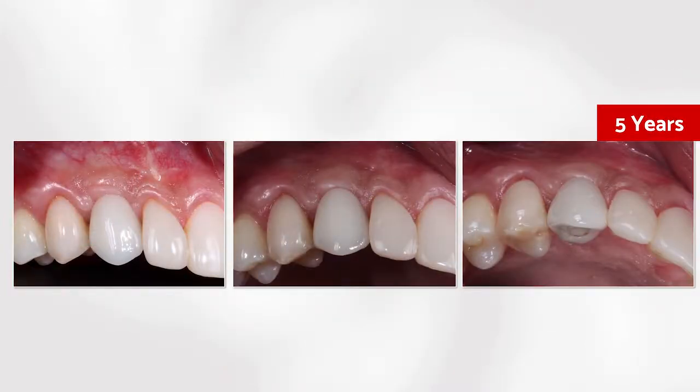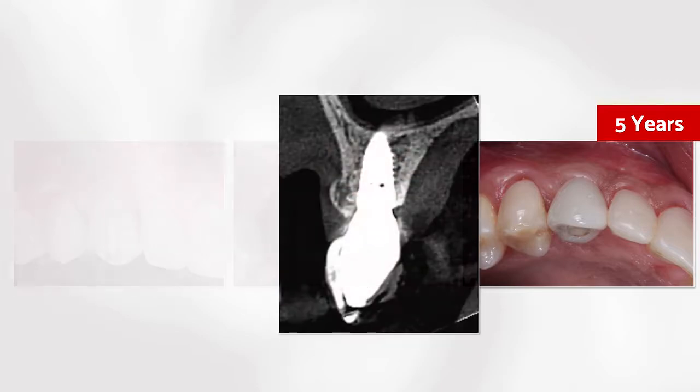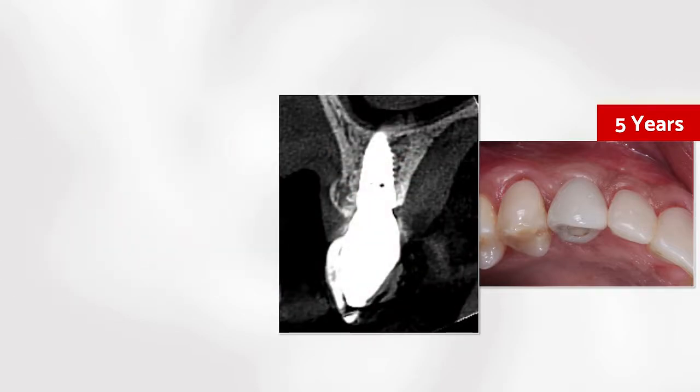We have the maintenance of the anatomical contour of soft tissue and the gingival margin and the papillary height position. And here the CBCT scan. Let's take a look at this image. We have around 3 millimeters of bone at the buccal aspect, the new buccal bone wall, and a relevant thickness of soft tissue. The bone graft that was placed above the implant platform remodeled and is still stable above the implant platform. That's amazing.